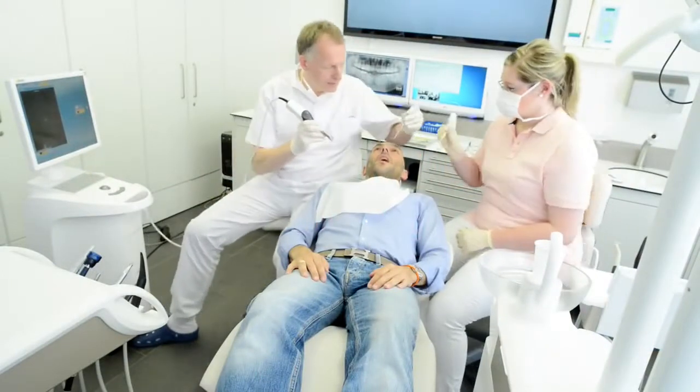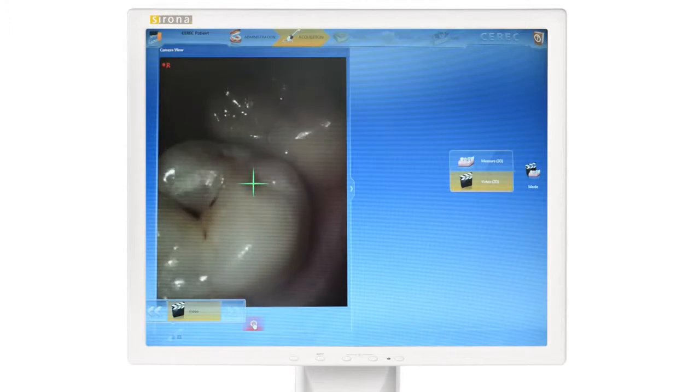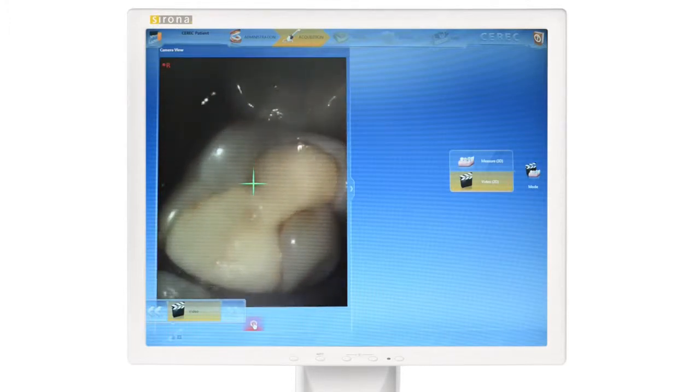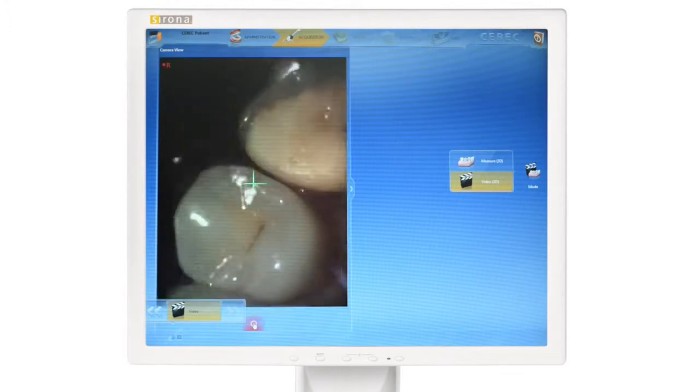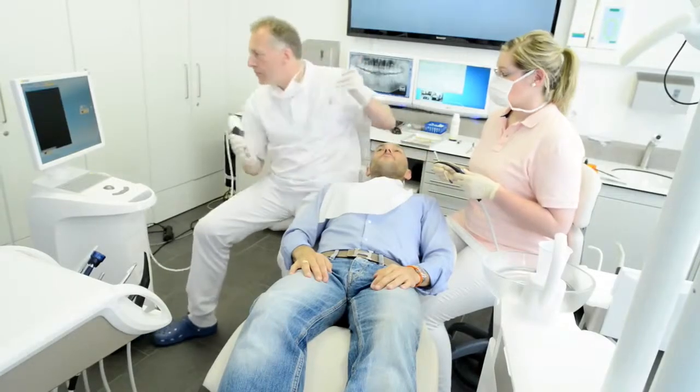We'll start with the patient counseling mode, available only with Omnicam. Using the full color camera, a video of the situation can be made and used for patient education and clinical security. Once the patient accepts the case plan, treatment can begin.